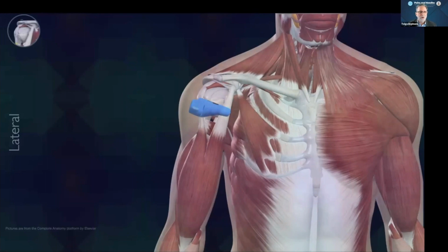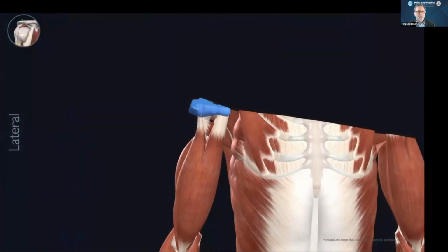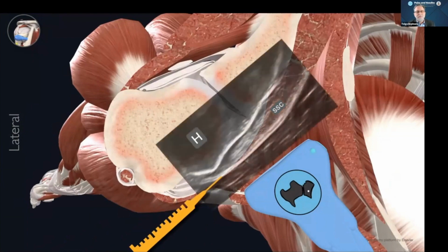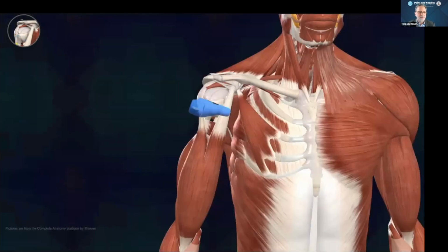When you put the transducer over the anterior window of the shoulder, like this, the ultrasound beams cut the tissue. In this sonogram, you can see the subscapularis tendon. This is a long axis view of the tendon. A fibrillar pattern is seen along the tendon, which inserts into the lesser tuberosity.